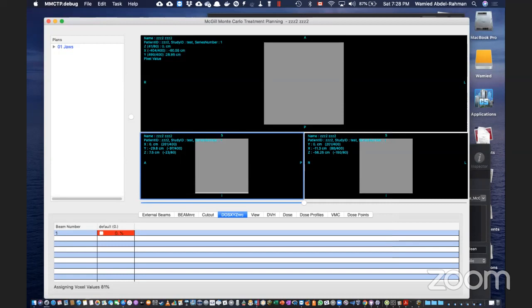When we do the calculation, you will find a 6 millimeter discrepancy, it's a bit off. So what I've done, instead of modifying, I could do one of two things: adjust the width of the MLCs, or I could move the MLCs, bring them closer, for example, to the patient.